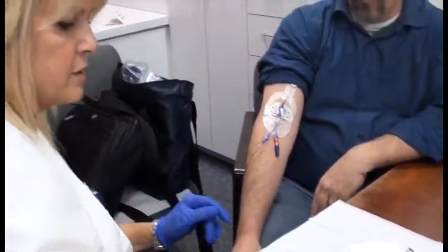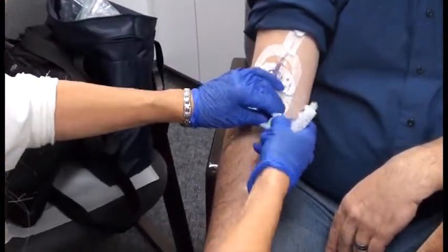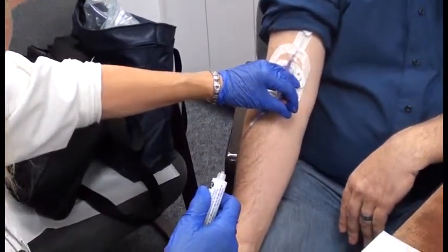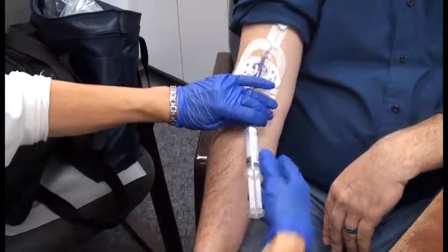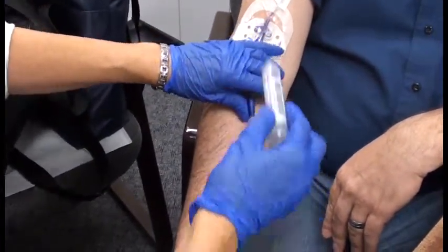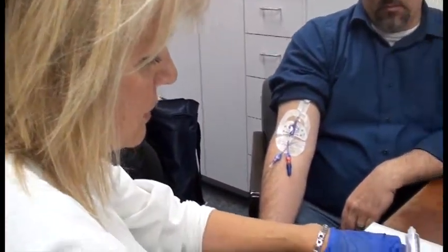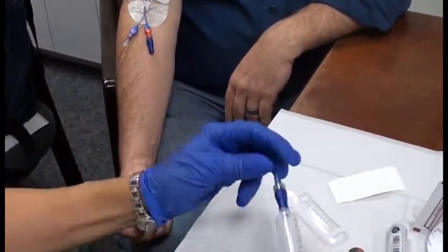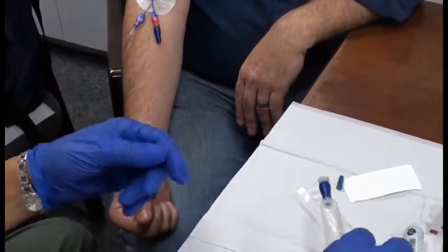What I'm going to do now, Mark, is just wipe the cap again, and I'm just going to give it a flush. There's a little bit of blood in the tubing, and we're going to give it a flush with some saline. Give it a push pause. And then this other syringe that has saline in it, I've got the air out of it, so I'm going to put it into the cap, and I'm going to prime it a little bit to get the air out of the little bit of air that will be in the cap.